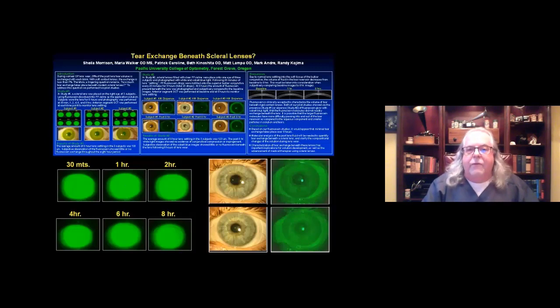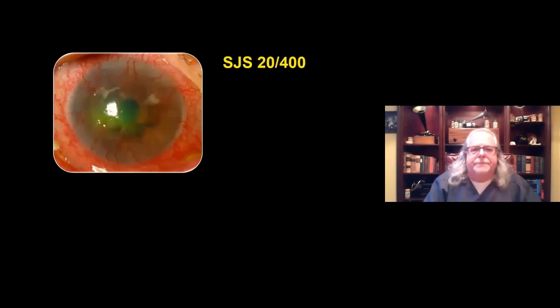So these corneas that have pathologically dry surfaces, their surface properties are maintained by the presence of this very closed fluid-filled system. So once again, a very kind of exciting thing that we have this kind of modality that has this many features to it.